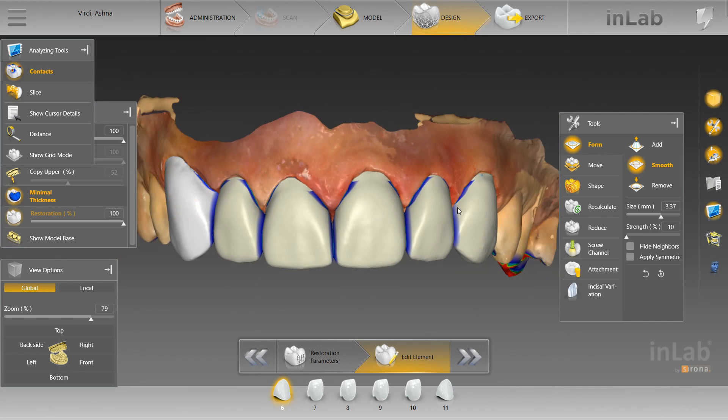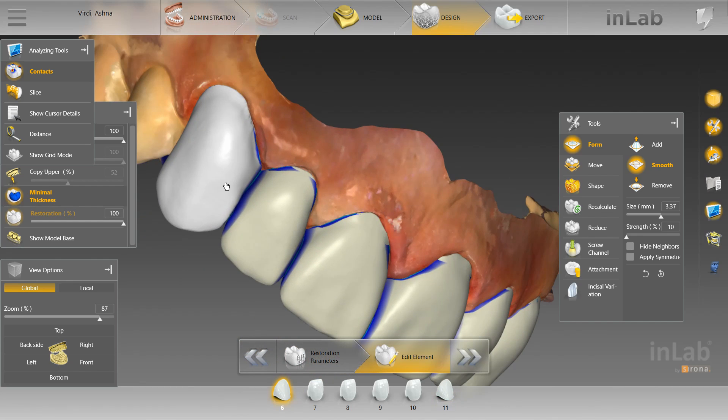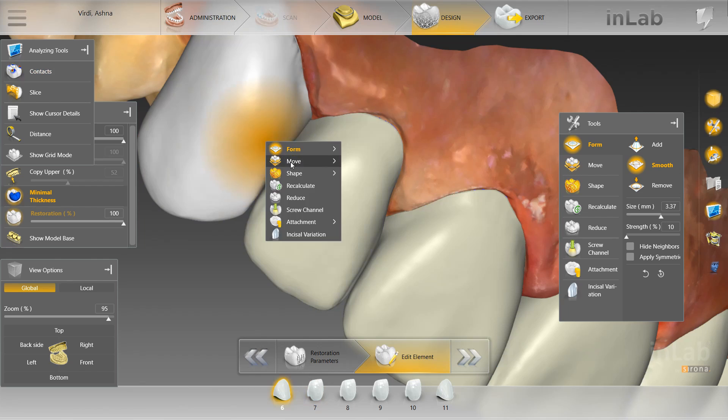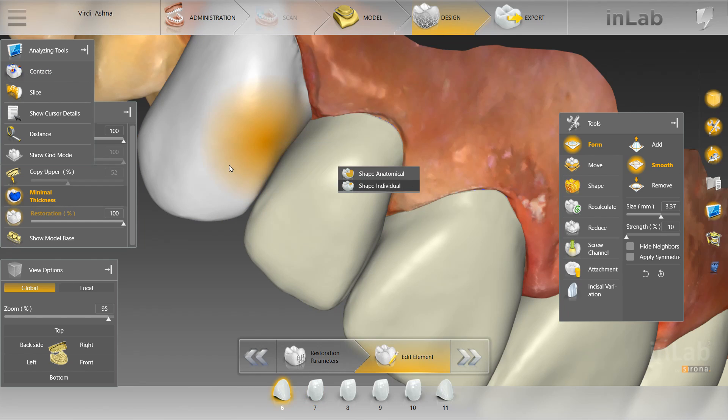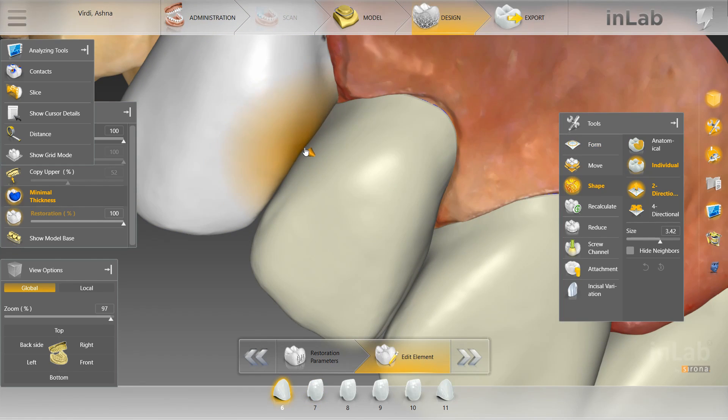As you can see, it already looks a lot better — a whole lot better — just from smoothing out those margins. Now what we're going to focus on is the contacts. I will fast forward through that as well, but I will touch on just a few key points that are important when doing your contacts. When you are doing your contacts, you can take away the contact color, and then what you want to focus on is getting a nice vertical emergence into each crown.